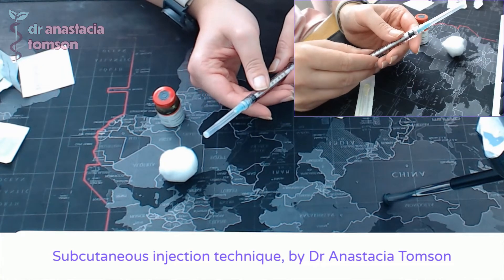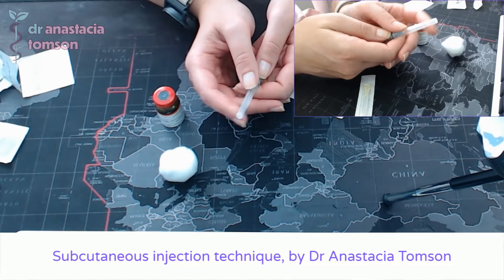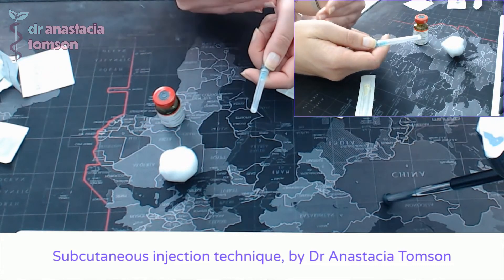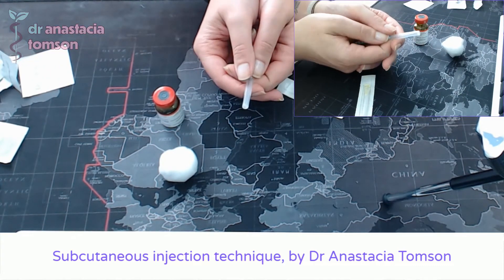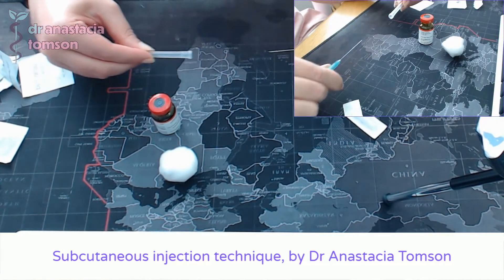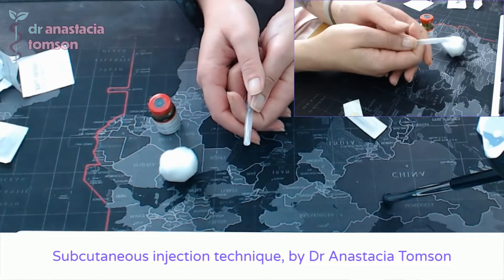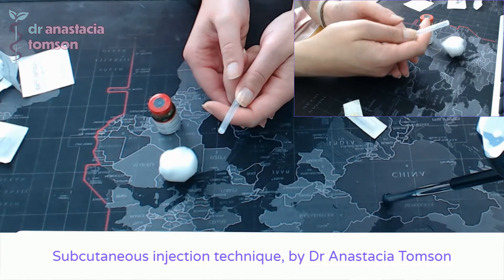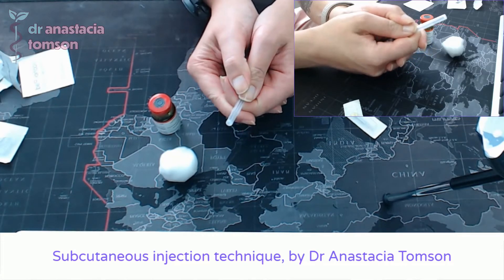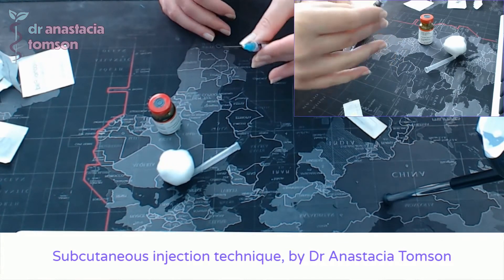Now I'm going to loosen the cap on the needle. The tip of the needle is here, so I want both of my hands behind the tip of the needle to make sure I don't hurt myself. If I open the syringe with my hands in front of the tip, as soon as the resistance gives I could have a reflex and potentially injure myself. Instead, I'll pinch the plastic cap between the bend in my index finger and my thumb, use my other hand to support it, click it free, and then tip it off down onto the mat.